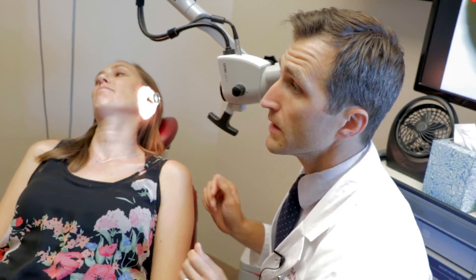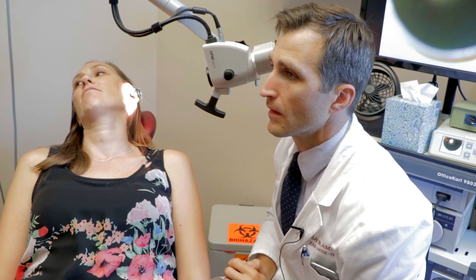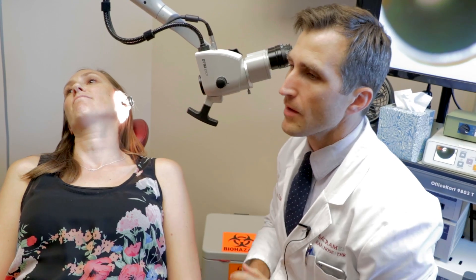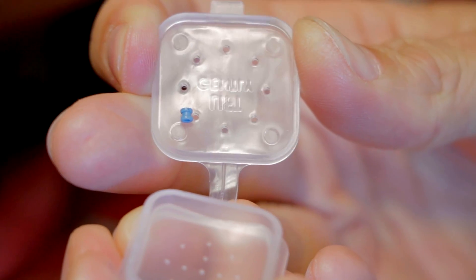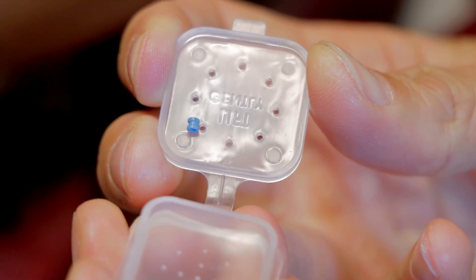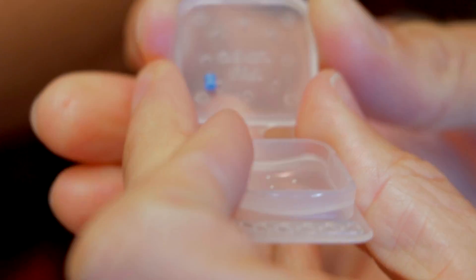Here's this back. I'll go ahead and take the tube please on a little alligator. Can we get that up-and-down one? I'll take a tube too. So open this up — that is one of the smaller tubes that we use. It is a mini, short-acting tube which is only designed to stay in the eardrum for about six months. It'll fall out, and basically this just hangs around in there to make sure that the fluid doesn't reaccumulate.